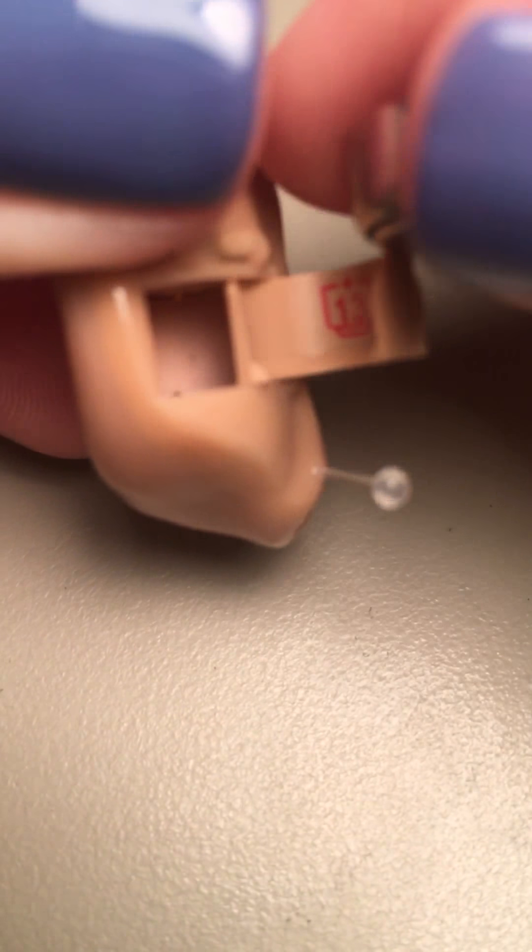We have some batteries here. This is a size 13 battery — it should last about a week and a half to two weeks. When it starts going dead, the battery will make the hearing aid beep. So if the person reports a beeping sound in the hearing aid, you'll need to change the battery.